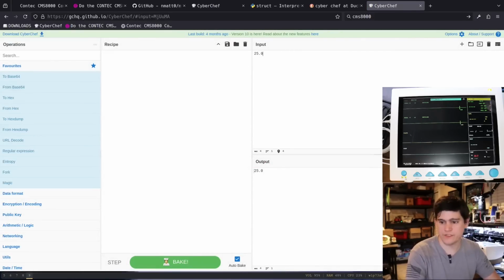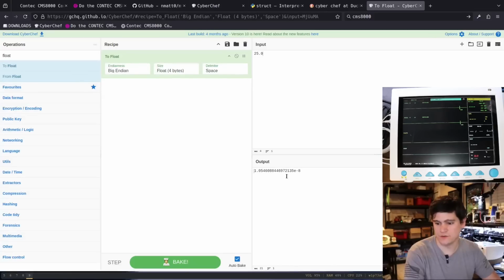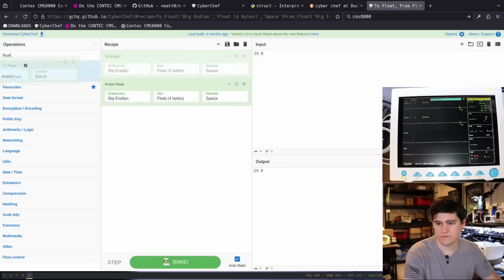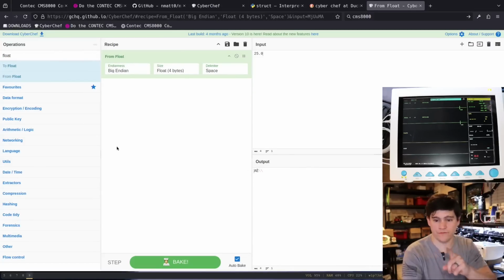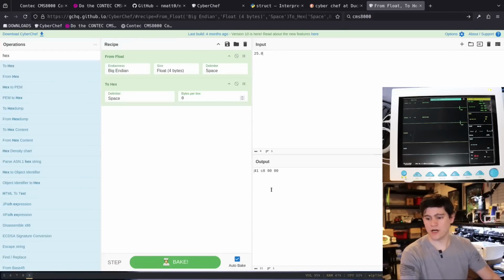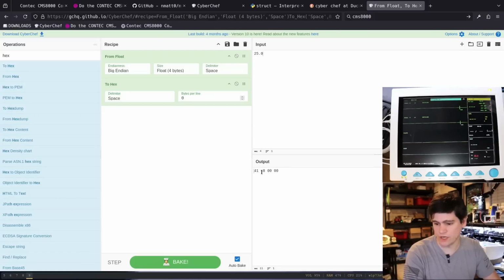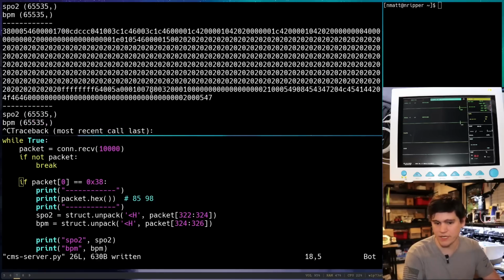Okay, 25.0, float. Yeah, so we're going to change it to a float. And then what I want to do... Wait, no, I want from float, right? Yes, I want from float. And then I want to say to hex. So here is what the floating point number should look like in our data stream. So 41 C80000. So let's look for a 41 and a C8 in our binary data.